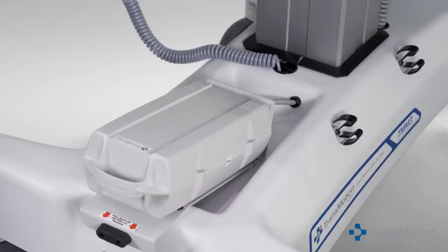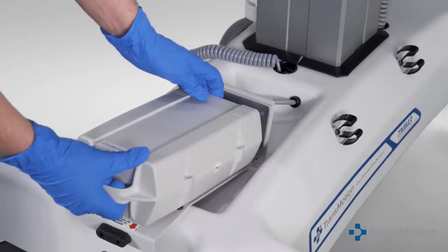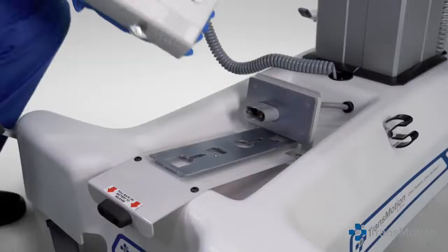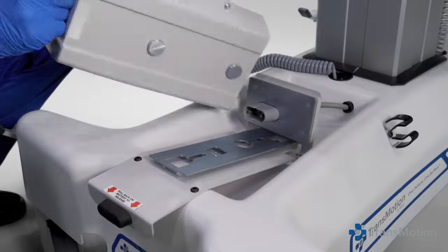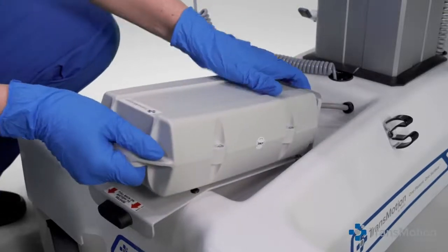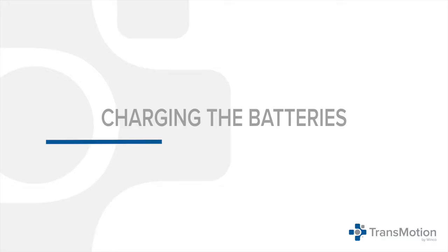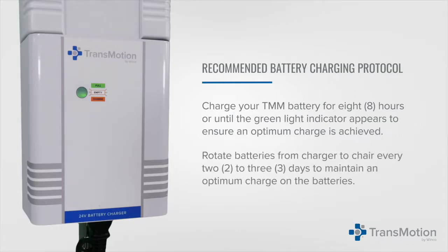To remove the battery pack from the chair, grasp the integrated handle on the battery pack and pull back until the locks disengage, then pull the battery pack away from the mounting bracket. To install the battery pack, place the two circular pins on the back of the battery pack into the square openings on the battery mounting bracket. Once in place, slide the battery pack down until the locks are engaged. Charge the battery for eight hours or until the green light indicator appears to ensure an optimum charge. Rotate batteries from charger to chair every two to three days to maintain an optimum charge.